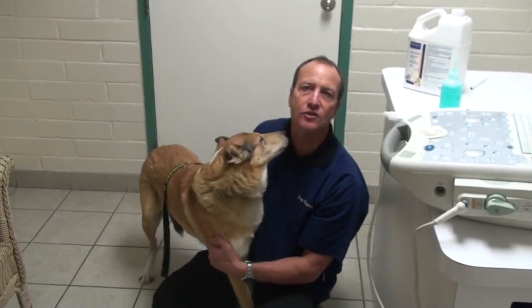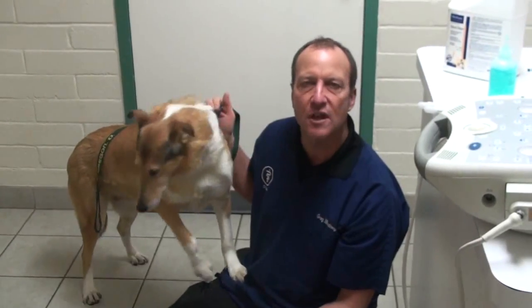Ultrasound, if you do it too early, can also be inaccurate — it will miss the babies if it's done too early. X-rays are usually taken after 45 days to see the numbers. Ultrasounds won't really detect the numbers as well; they'll show you that the babies are there and viable, but won't accurately count them because it's hard to separate the images.